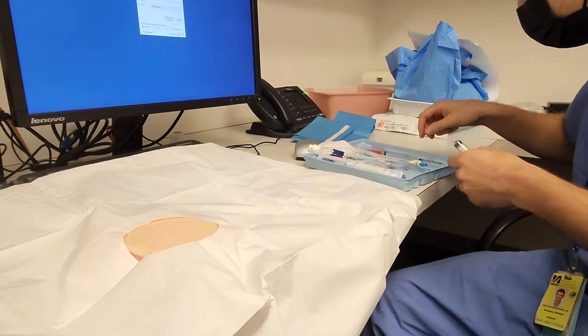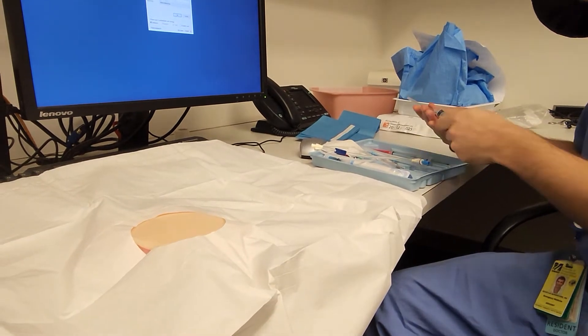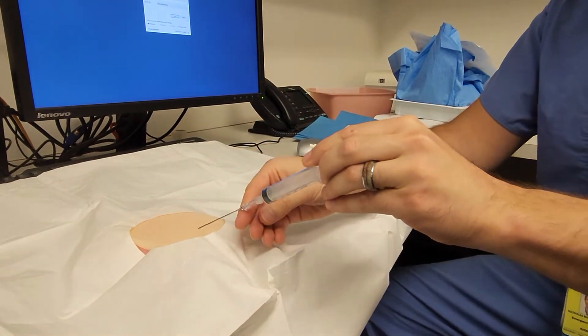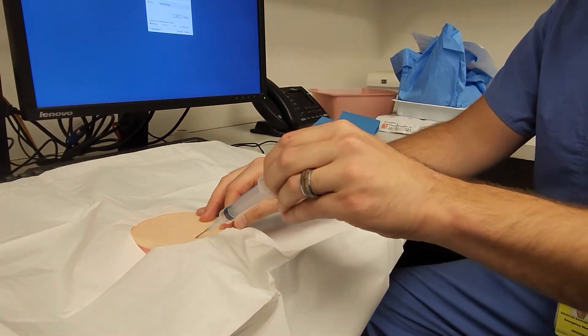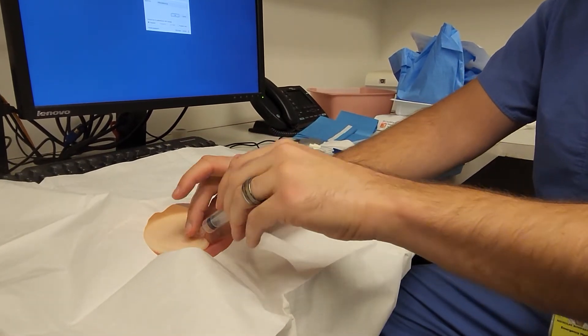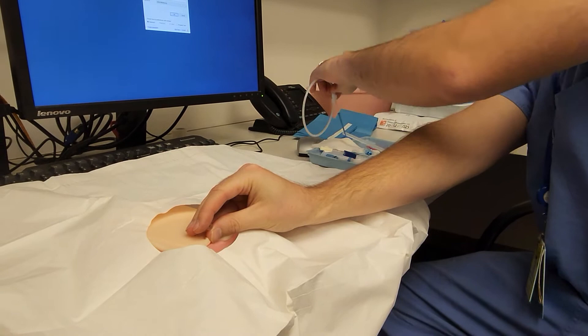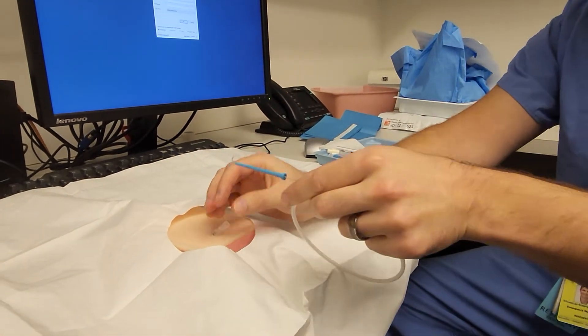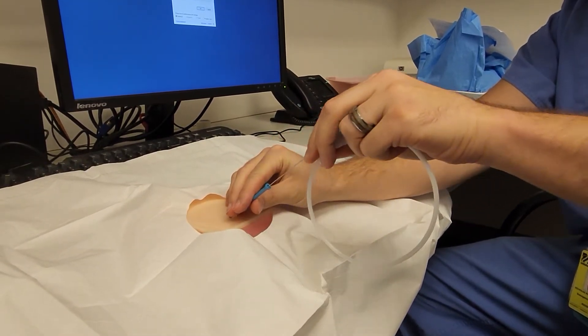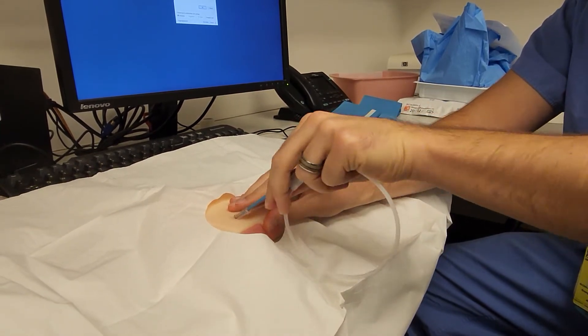You will then use your finder needle and ultrasound, going in at 45 degrees, following the needle tip until you get flash. Once you get flash, stabilize, remove the syringe, and then use your guide wire and insert it.